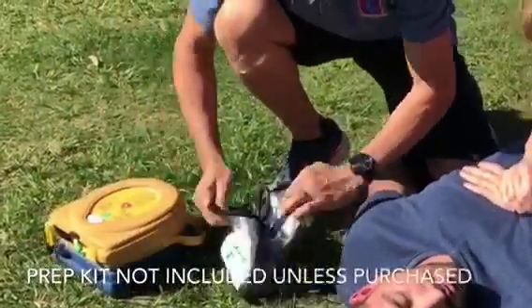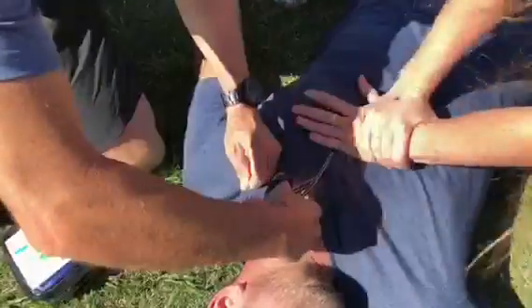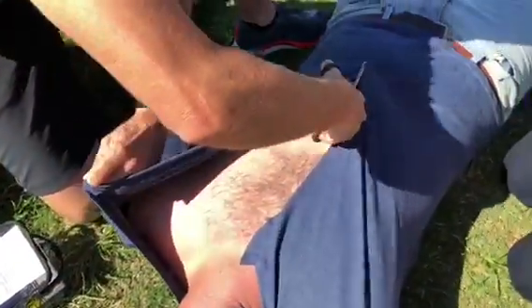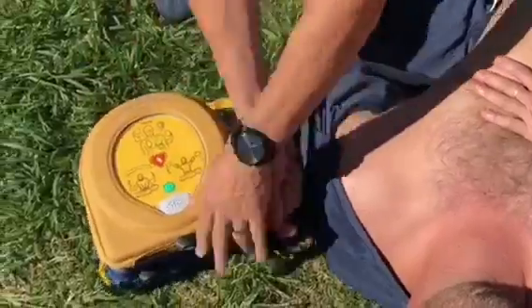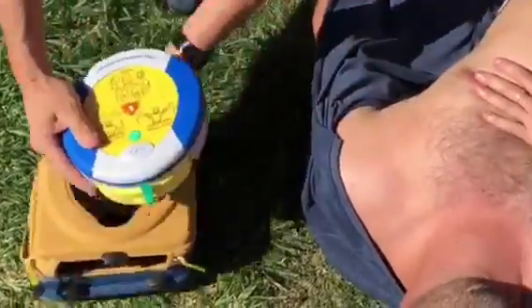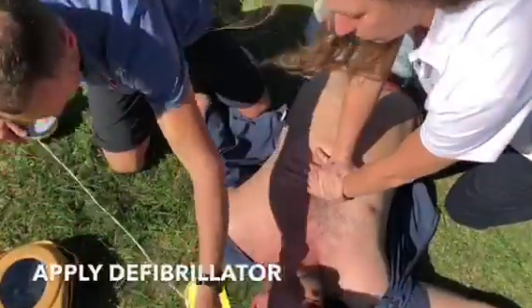In the back of the carry case of the defibrillator, you'll find a patient prep kit. There'll be a pair of shears. Simply take them out and take off any clothing, which includes bras, t-shirts, or any swimwear on the top part of the chest. Once that's been achieved, then take the defibrillator out of the pack, turn it on, and follow the voice prompts. Pull green tab to remove pads.